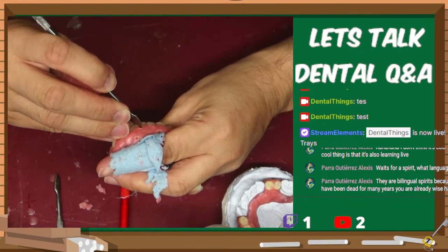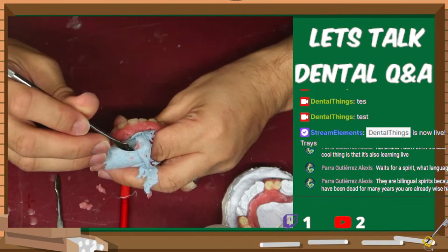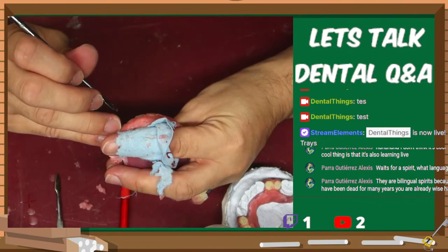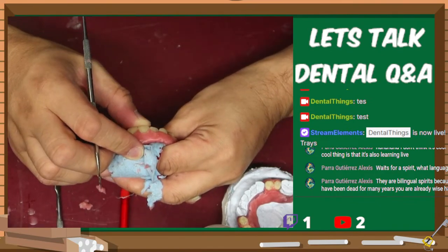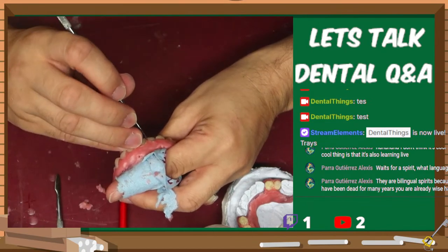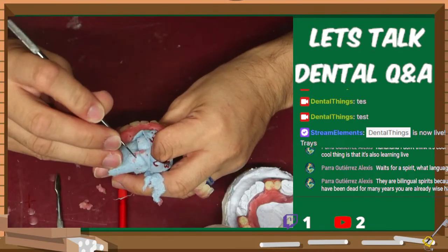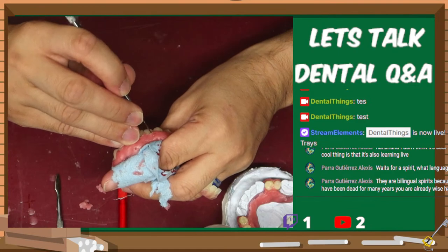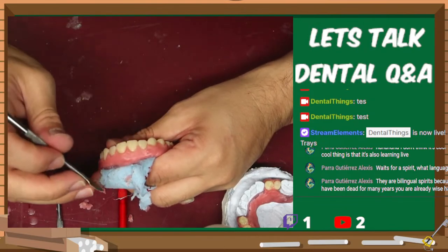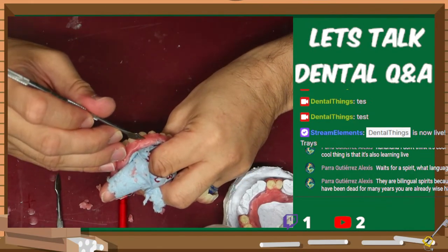So if I go and shoop. And then I don't want it to feel lopsided. It's kind of lopped already. I can move on to this one, which will be right about there. A little bit more rounded out there. A slight bit lower than the central, which is good. Just a hair. And then we're going to go a lot lower, a lot longer over here in the canine, which will be right about there or so.